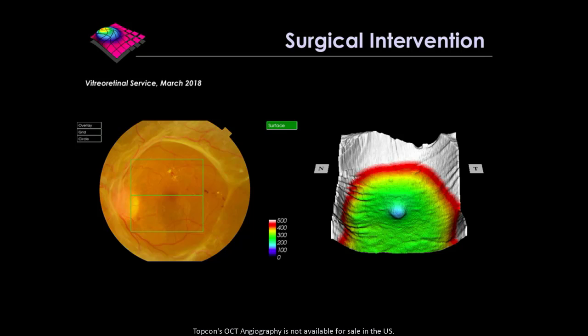To be honest, I'm not even sure they particularly looked at this, because the vitreoretinal surgeons are often much more clinical in the way that they make their decisions. And they say in the notes, macula on TRD, observe. Now I think perhaps they wanted to let the dust settle a little more from the surgery in the right eye, which I think was quite a complex surgery.